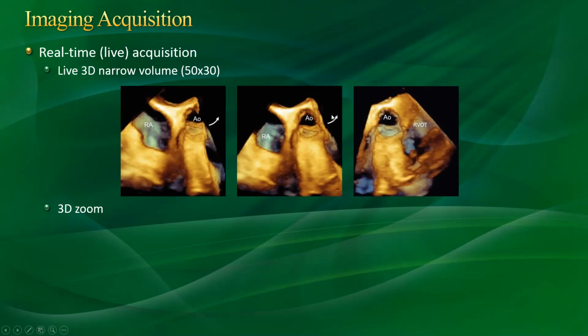You can go on the center, and you can go more lateral to get your RVOT. So you can control that without dialing your probe. Just wherever you are, you just hit one button to go from lateral plane from left to right.